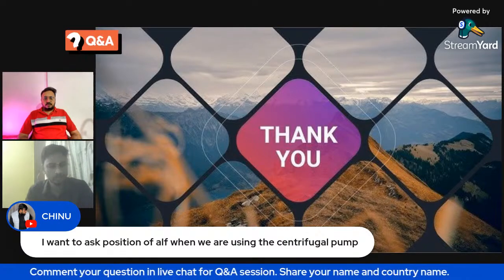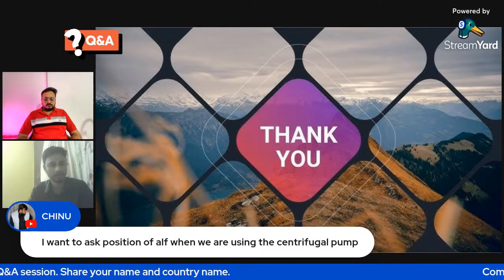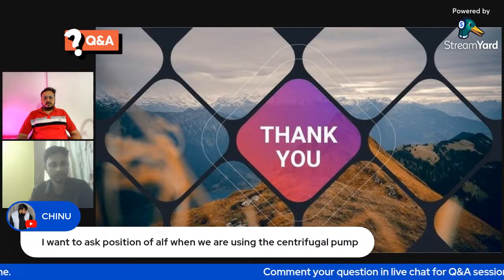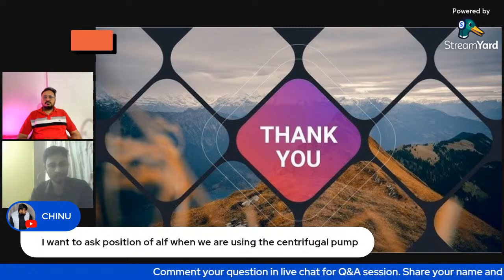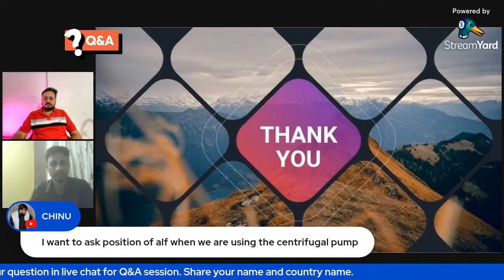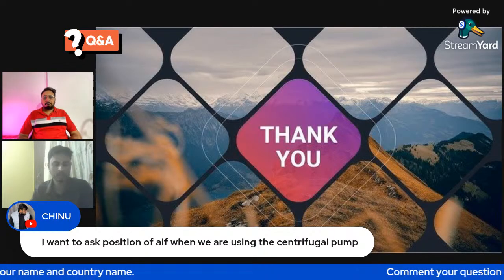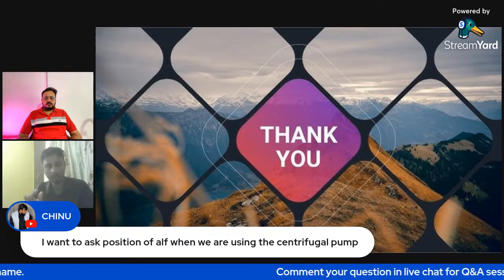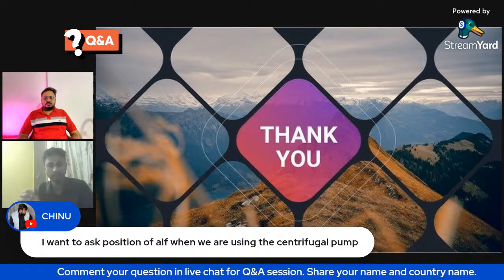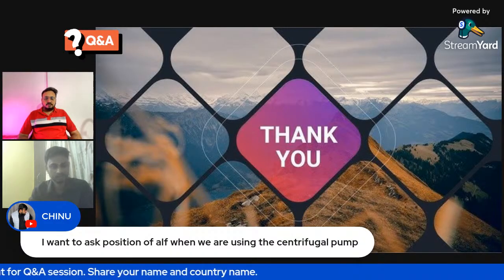So yes, if we are using a centrifugal pump, we definitely need an extra pump, because the centrifugal pump depends upon preload and afterload, and if resistance is more, centrifugal pump flow is very low. It is not going the other way. The centrifugal pump majorly depends upon RPM and aortic resistance. If there is more resistance, the centrifugal pump pressure is high, because pressure is not created with a centrifugal pump for filtration.